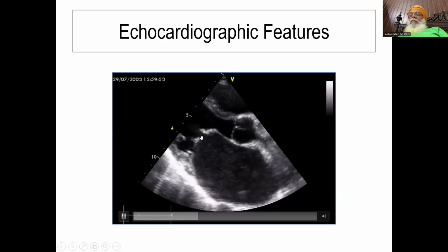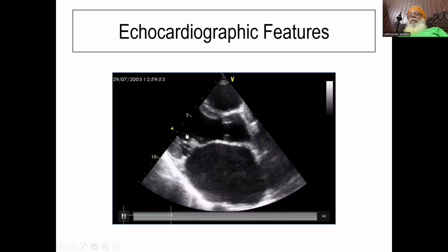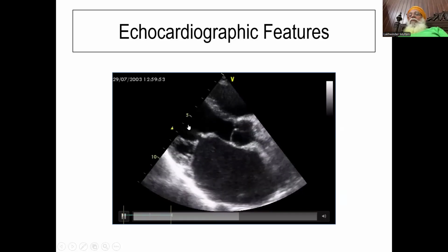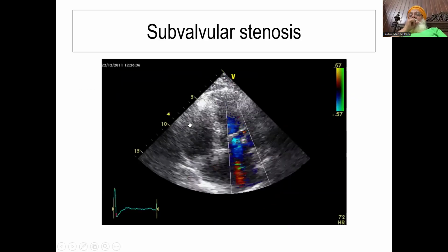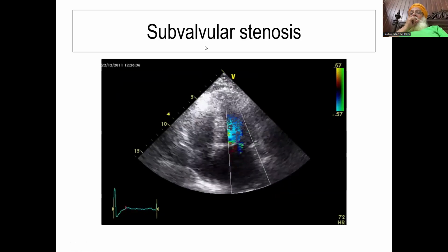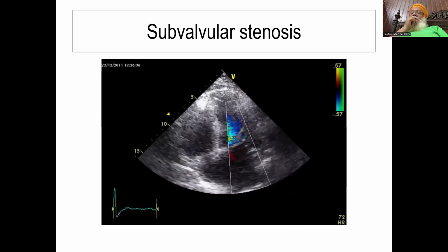One variety is where we have valvular lesions. In some of the cases, the valves remain okay, but the subvalvular apparatus in the form of cords as well as papillary muscle, and preferably the cords, they get inflamed and finally get fibrosed. And when you see this kind of phenomenon, what do you see? You will see a significant turbulence, not at the level of valve, but at the level of cords. And this is one condition. If you happen to measure the mitral valve area, it will be normal.